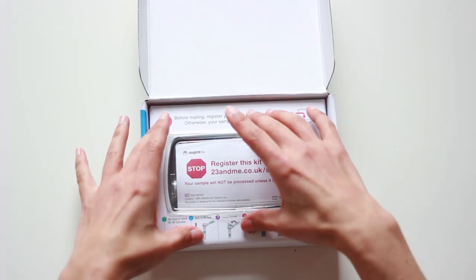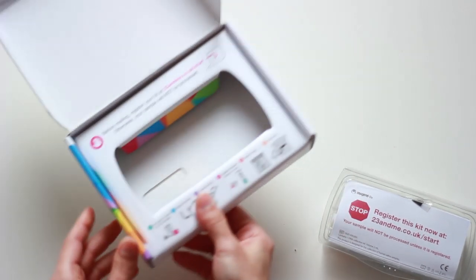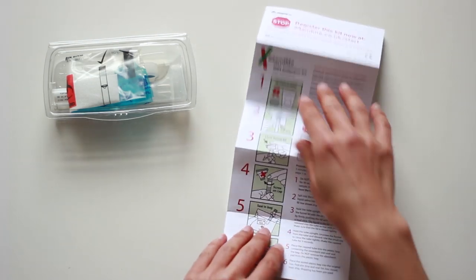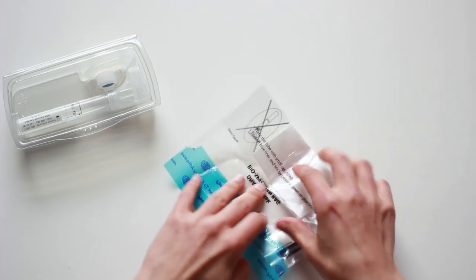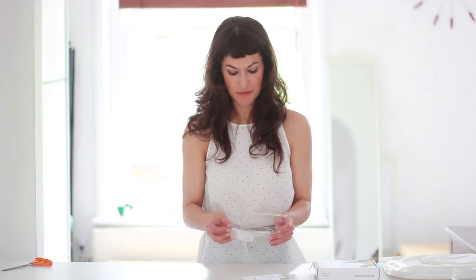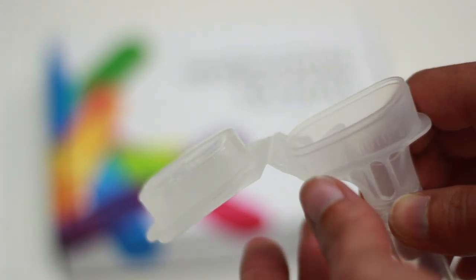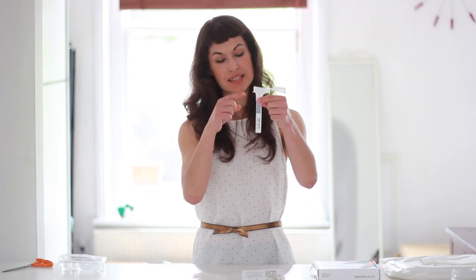Now that we have registered, we can continue unpacking. Don't throw away the box because this is the same box that you're gonna be using to ship back your sample. Here is the rest of the kit and we have the instructions — two pages with further information. The images explain very clearly what we have to do. We have the little bag that you're gonna use to ship your sample back. And finally, the tube. It has a funnel and that's to make it easier for you to spit. You will notice there is a liquid — it's called a buffer — to maintain the pH of your saliva.